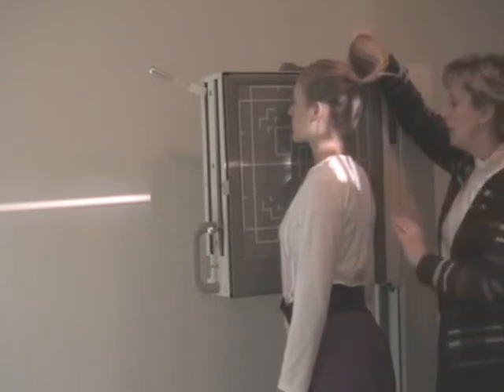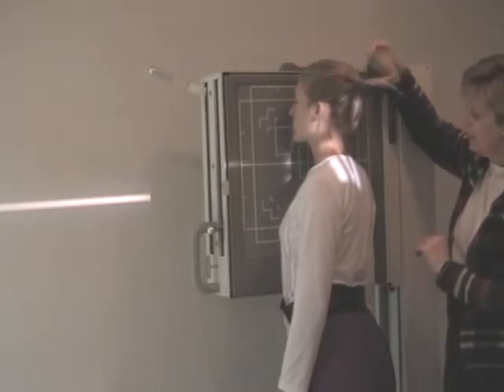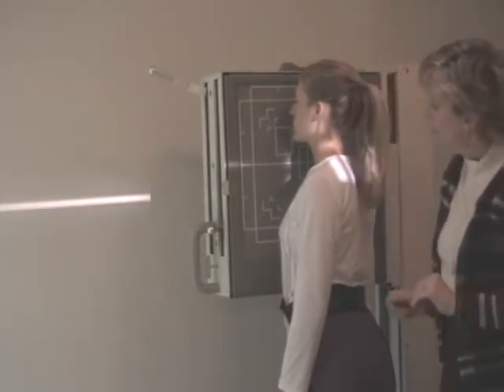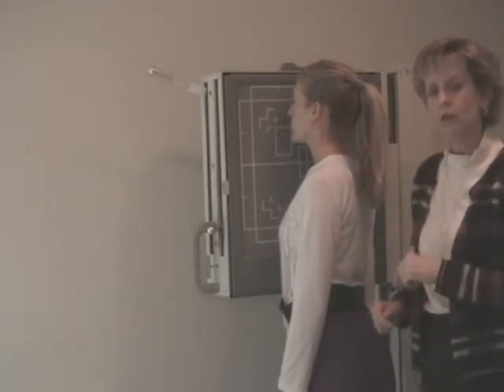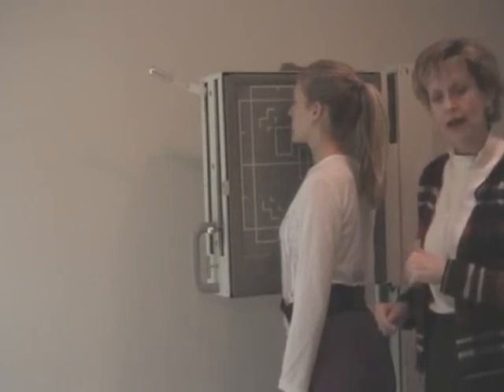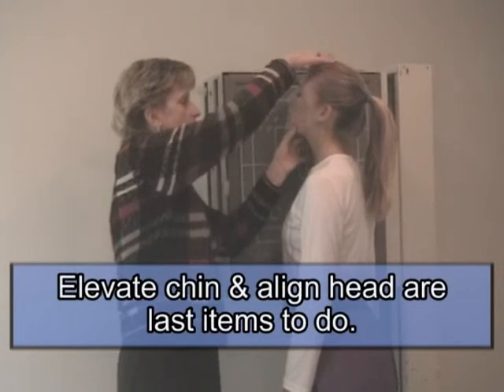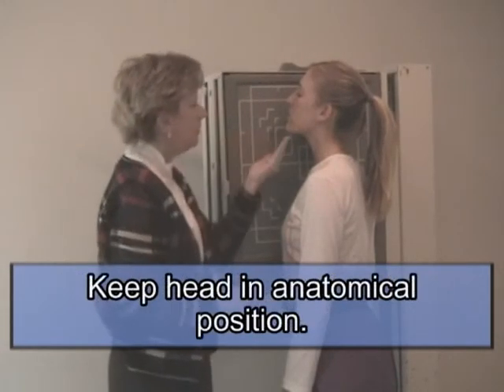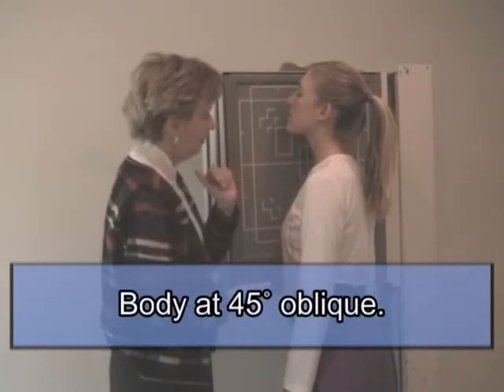Shoulders relaxed because you need C1 through C7 again. Look at the shadow of the board, get the neck centered. You have an R marker in there, 10 by 12 cassette, lengthwise, ID to the top. RAOs demonstrate the right intervertebral foramina. You use a right marker on the right side. The tube is angled 15 degrees caudal. Chin, the last thing you want to do is elevate the chin and have her head straight. Okay? This keeps the head in an anatomical position. The body is at a 45-degree oblique.